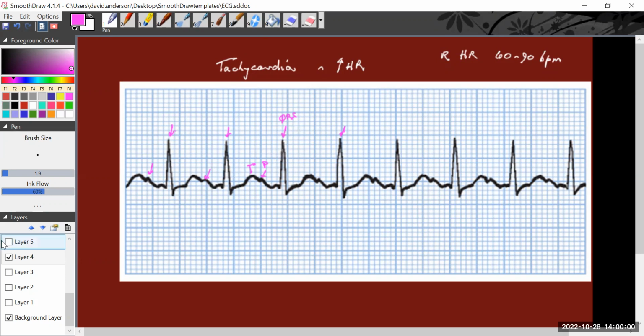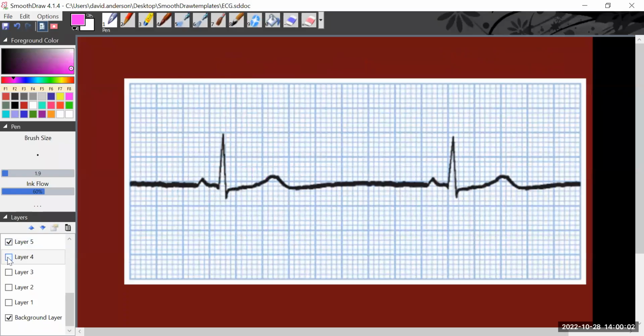The opposite to tachycardia is bradycardia, a slower heart rate. But again, we can see that the sequencing is good. What we have is a longer interval between beats. This would represent a longer filling time.